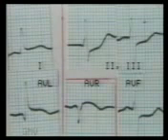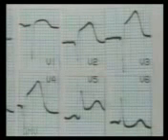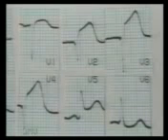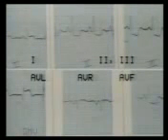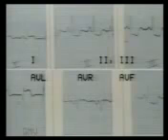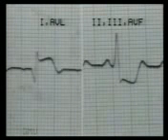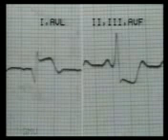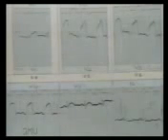This is an anterior wall infarct. The chest leads show ST elevation from V1 to V5, so this is an extensive anterior wall infarct. Note in V3, ST elevation of more than 5 mm. In this ECG, leads 1 and AVL show ST segment elevation and the T waves are slightly inverted, so this is a 2 to 3 day old anterior wall infarct. Leads 2, 3, and AVF show marked ST segment depression, suggesting an extensive infarct. More the depressions and elevations, more extensive is the infarct. Note in close-up view the ST elevation with Q wave in anterior leads and reciprocal ST depression in inferior wall leads. Note the very tall ST segment elevations from V1 to V5 — this is a fresh and extensive anterior wall infarct.